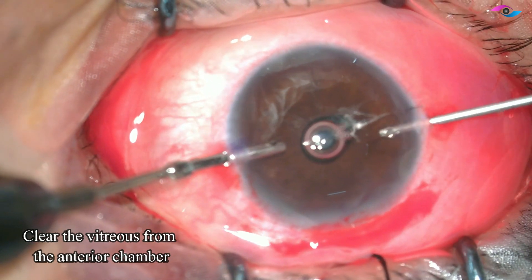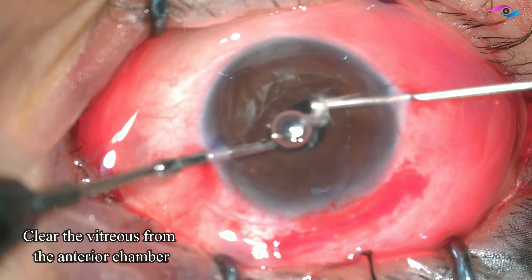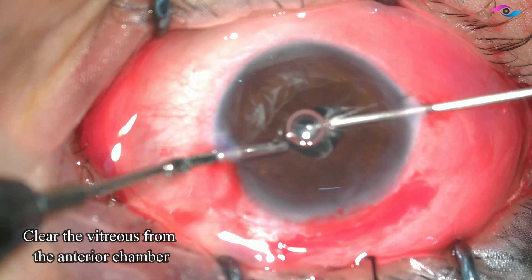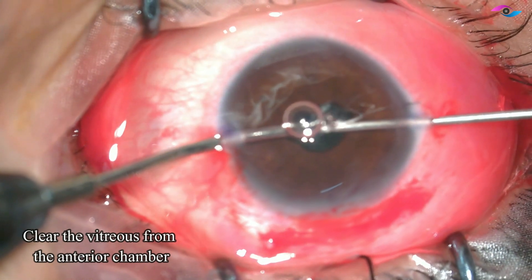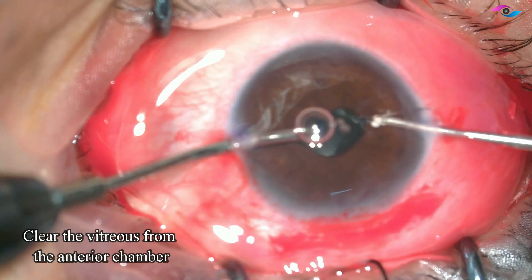I have not entered the anterior chamber yet — I have just made the tunnel — and now I am going ahead with the vitrectomy procedure. Before we implant the IOL, it is important that we clear all the vitreous from the anterior chamber. This is a thorough vitrectomy and the vitreous has been cleared.